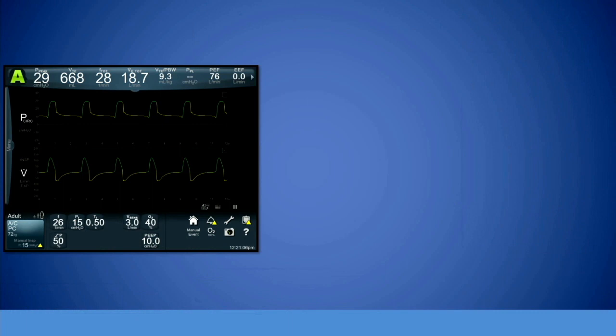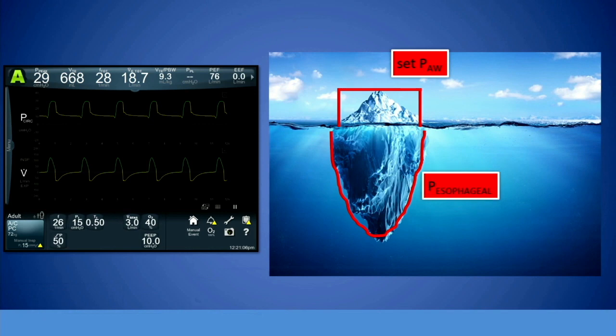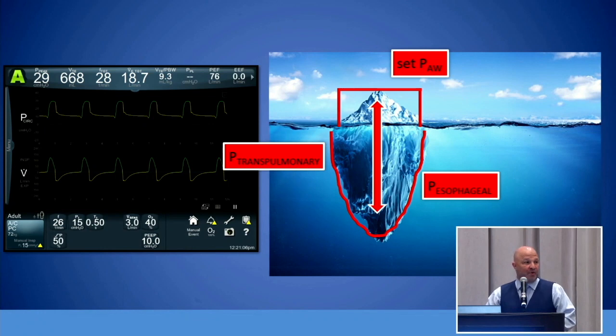This is how I look at the ventilator, a typical pressure control waveform, and I have this idea of an iceberg phenomenon. You see what's on top, that's on the ventilator screen, and that's your airway pressure graphic there in red. What you have to imagine is everything that's underneath. And that's what's going to hurt you, because if the patient sucks in really hard and drops their pleural pressure really, really low, that difference between the airway pressure and the basement of where they drop the pleural pressure is your transpulmonary pressure. And they will hurt themselves at that point. The mechanism is called patient self-inflicted lung injury, or PSILI. The research around this is unbelievably forthcoming, and we're going to know a whole lot more about how to handle a spontaneously breathing patient as we come forward, okay?